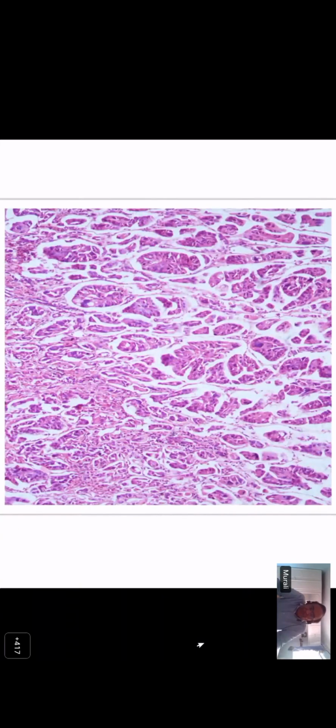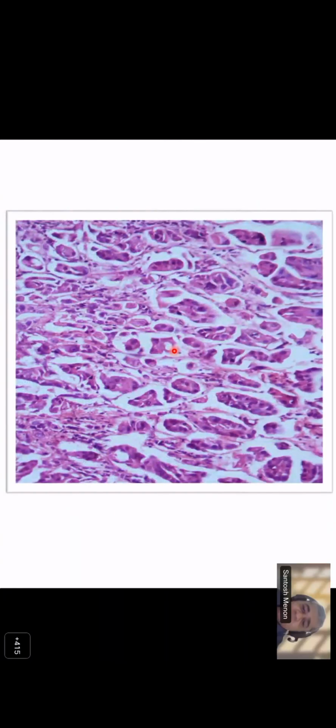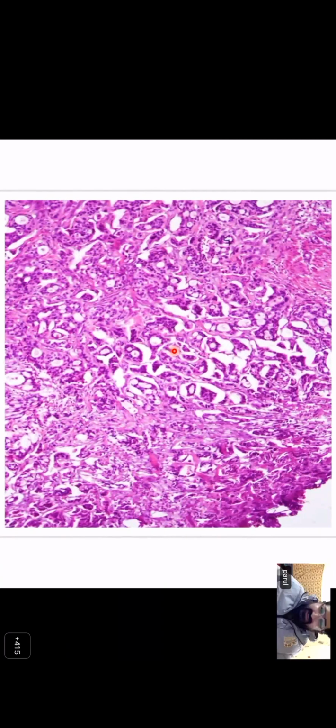Okay. So you thought these were lymphovascular emboli, or these were floating micropapillae? Floating micropapillae. Niharika, you thought they were LVSI in this? No, sir, micropapillae. These are all micropapillae. So have you seen this kind of morphology in urothelial cancer? No. Yeah, I remember one case. Variant of urothelial cancer. Okay. So we'll come to the terminology.